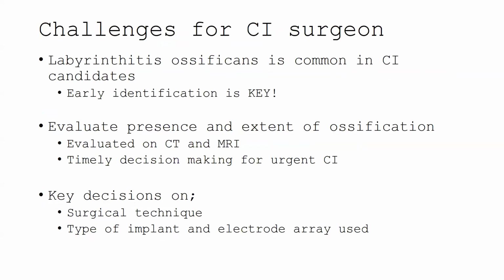So recent reports are showing that labyrinthitis ossificans is becoming challenging for cochlear implant surgeons because we are identifying it more, and early identification is key for better outcomes.